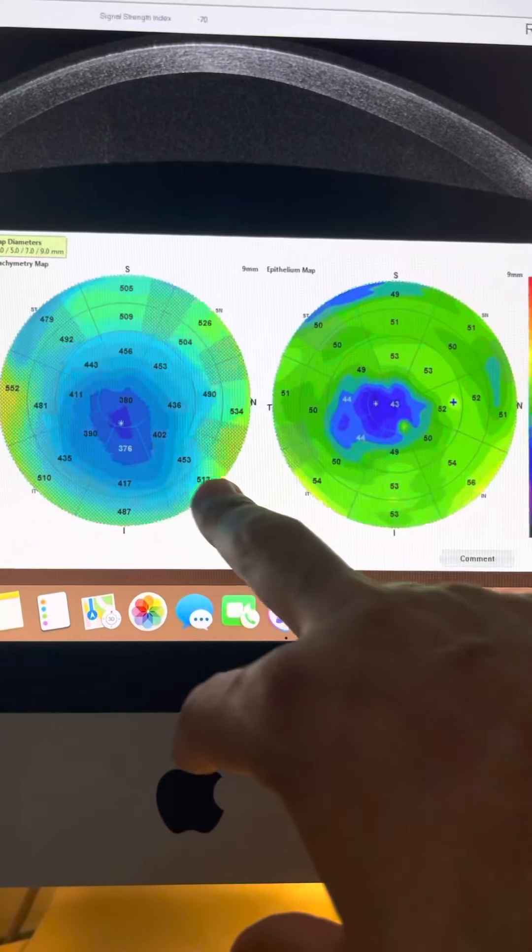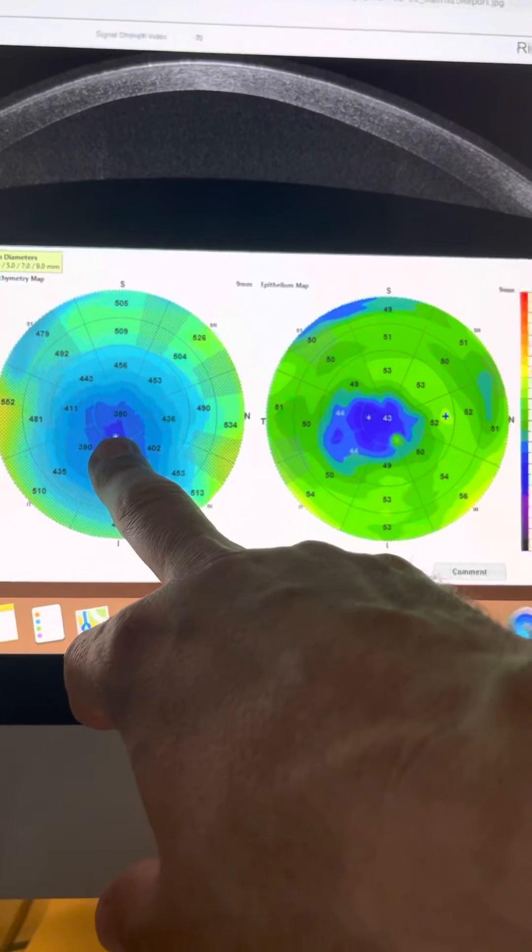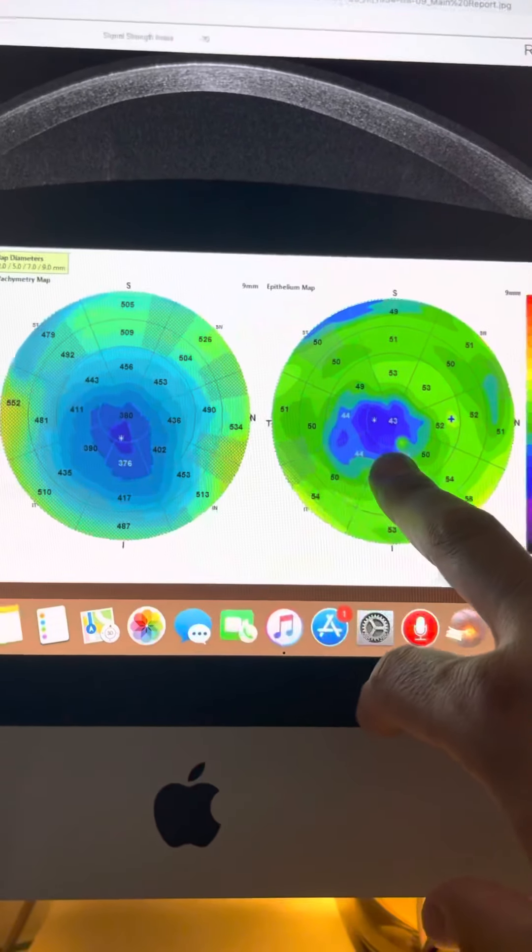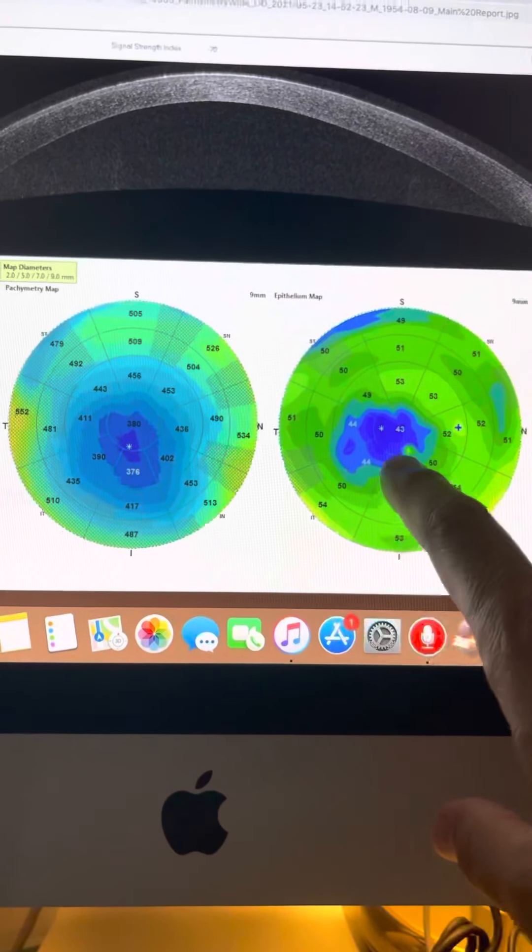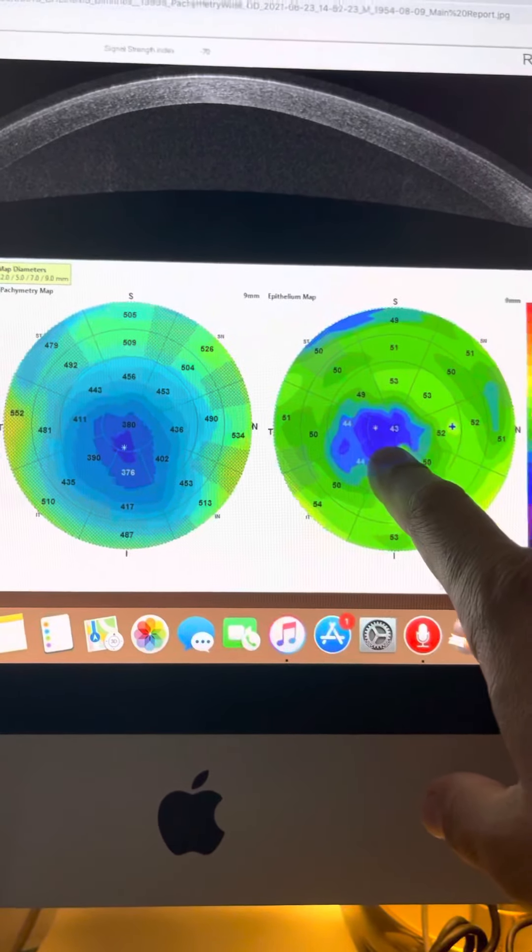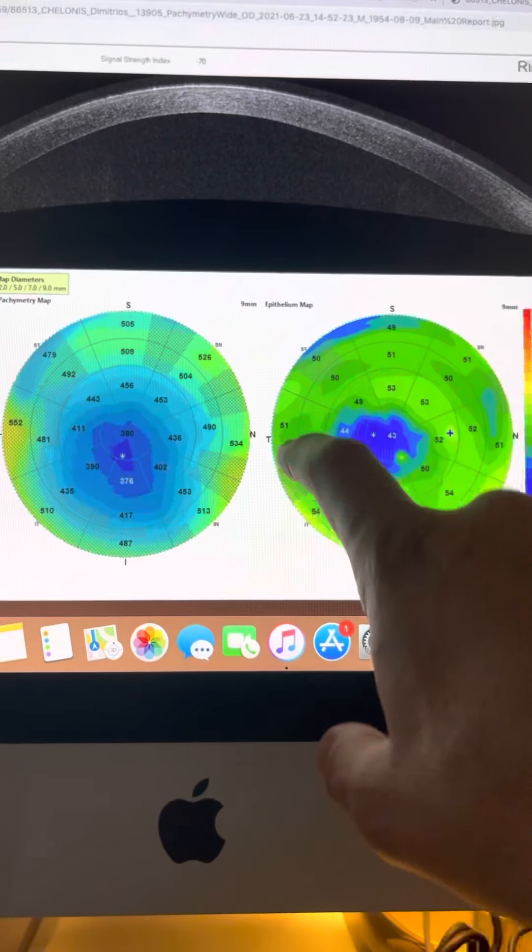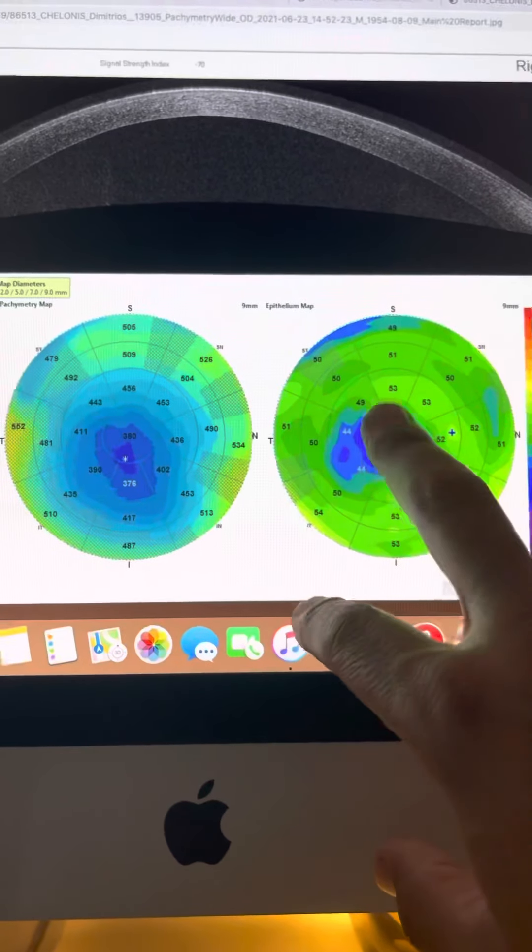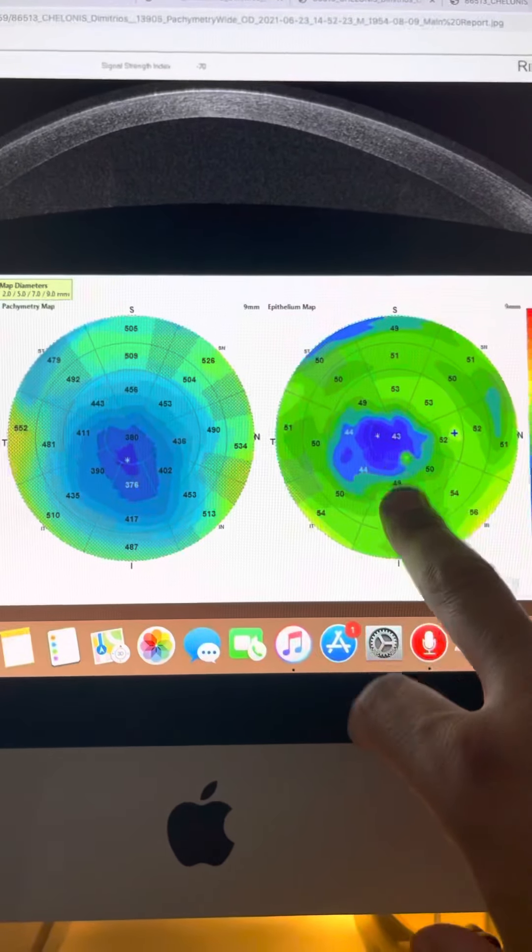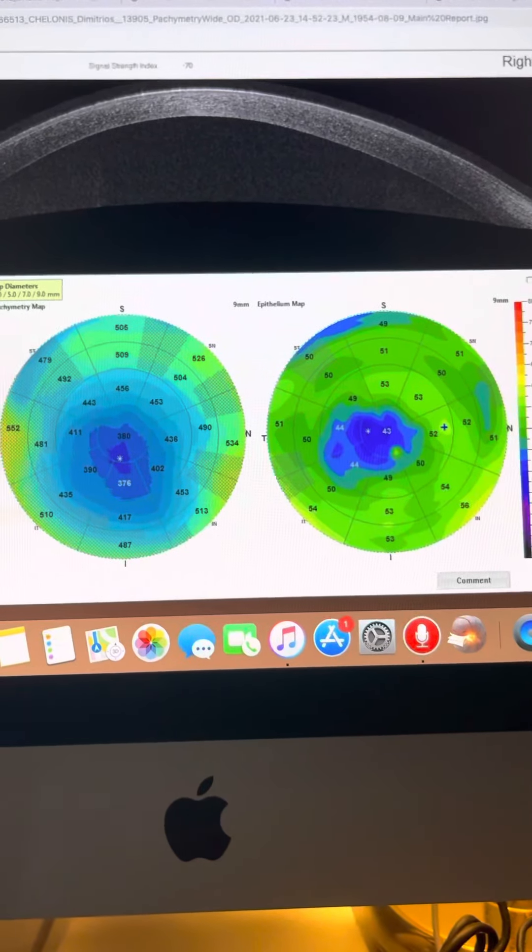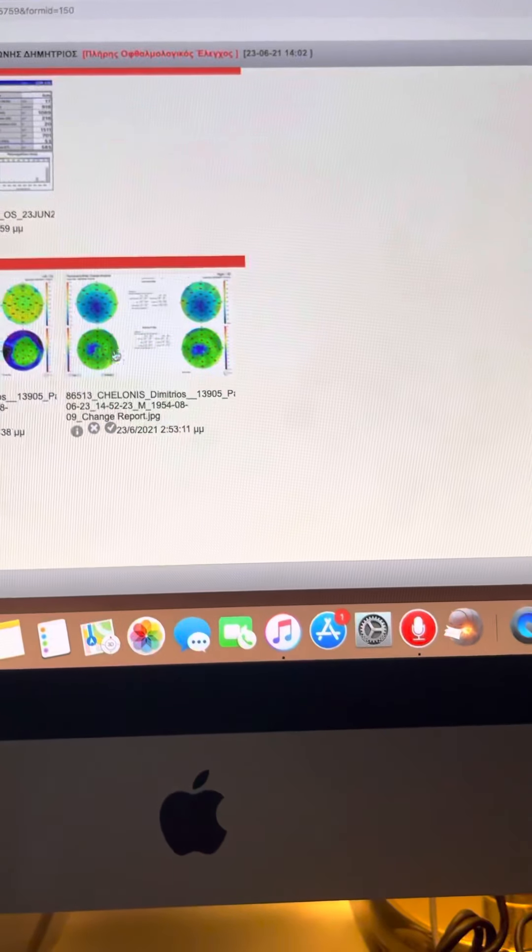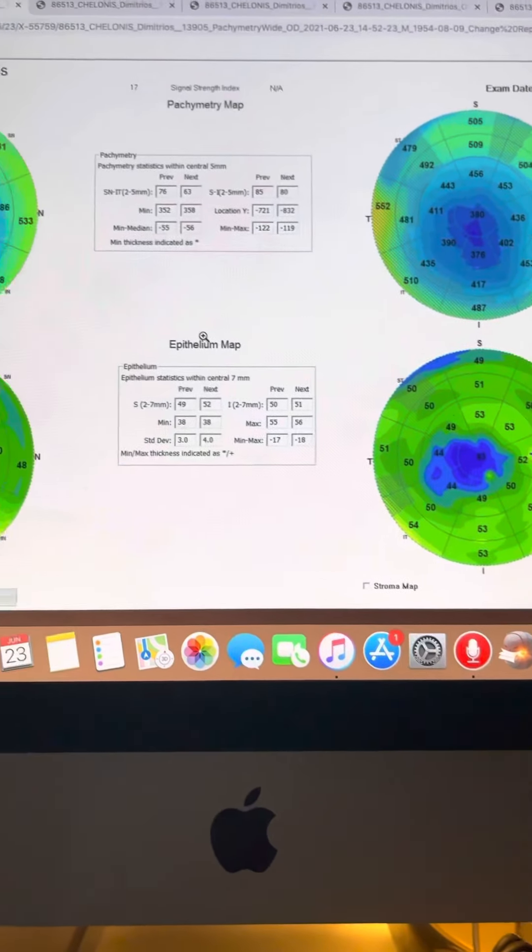This is obviously the thinning of the cornea centrally. There's epithelial remodeling in the peak of the cone, but there's not significant thickening around the cone, which tells us that the cone is probably not active.